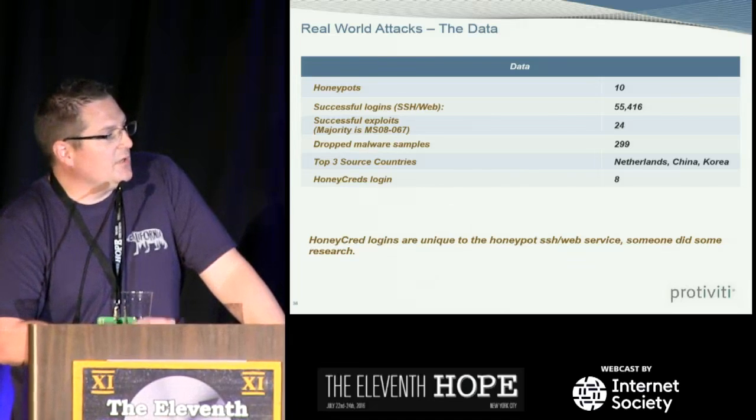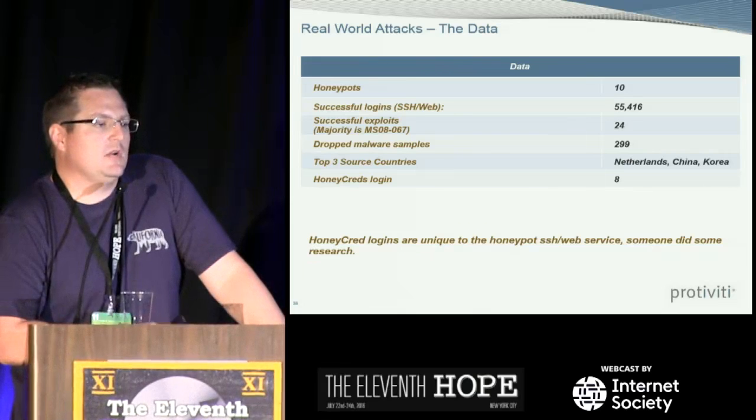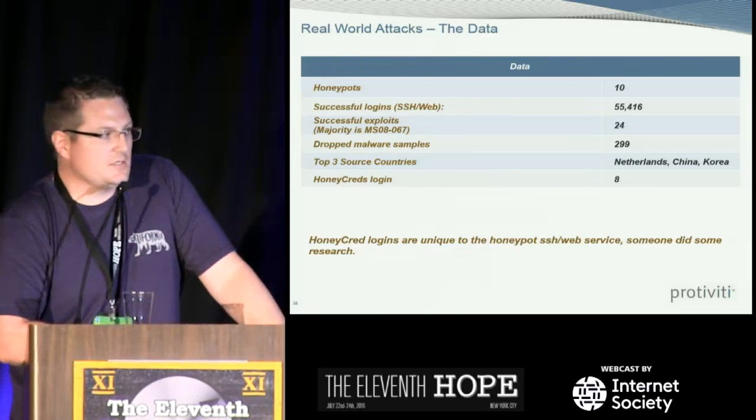Most importantly, overall, I think 8 times: we put those honeycreds, took a subsample of that, and threw unique usernames and passwords out onto Pastebin and onto Twitter and kind of publicized it like, hey, here are these medical devices sitting out here. Here are the creds. Go ahead and hack away. And 8 times those were actually used against the system.